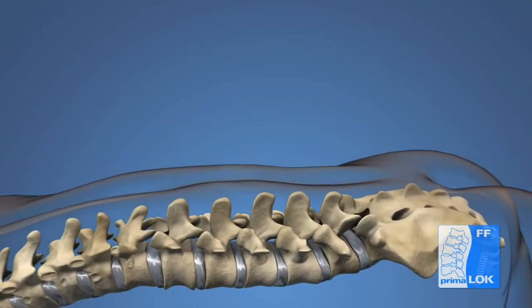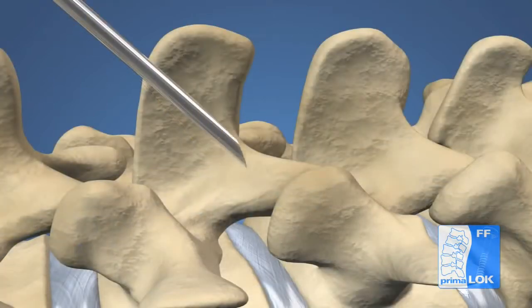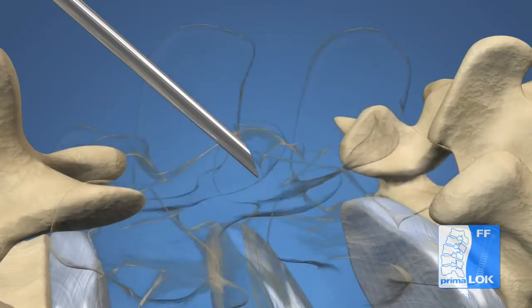Insert the single bevel access needle with the bevel facing up. This will help prevent the needle from skiving off the facet. Advancing of the needle through the skin incision is accompanied by repeated AP and lateral fluoroscopy to confirm precise placement of the access needle. Tap the access needle into the cortex of the superior facet.